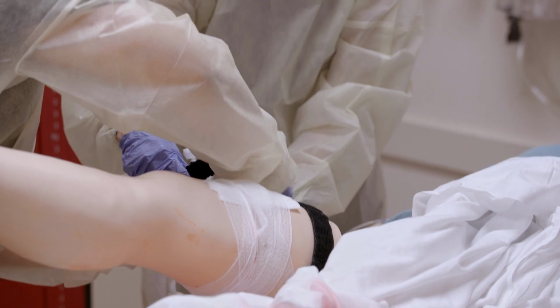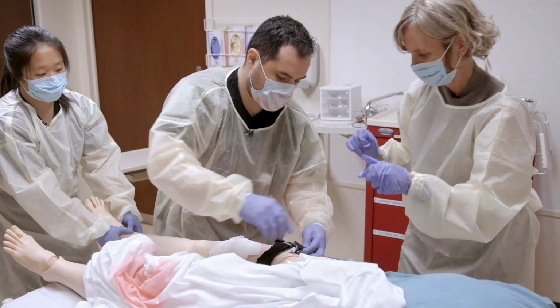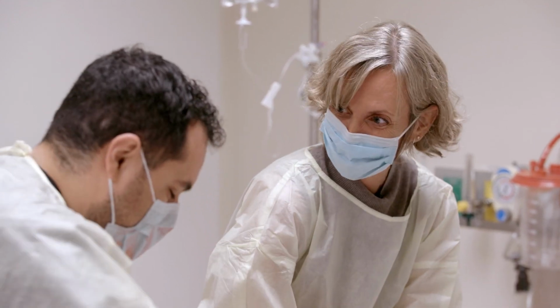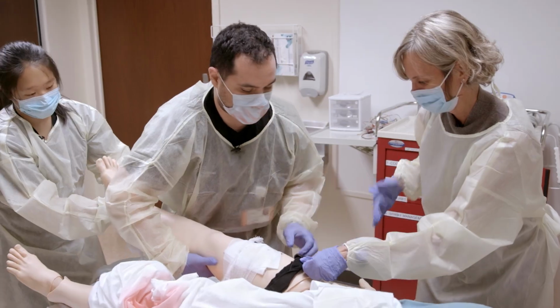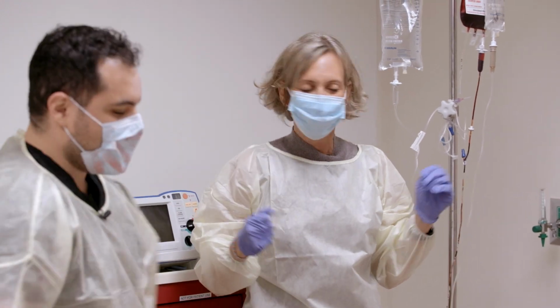We're gonna lift up the leg, bring it around. All right, and then you're gonna place it through this buckle here. Pull hard. Oh, is that how you're tightening it? Oh, God, this feels really tight. All right, and then you're gonna twist this around until it's nice and tight. Oh, that's some medieval stuff. Are you serious? Twist it hard. That's it. Yeah, how do you tighten it? Yup. All right, and then it's gonna go on this little notch right there. We stop the bleeding. I feel really dizzy. He's lost a lot of blood. Great job, Julie. I think he's gonna be saved. Yeah, you saved him.